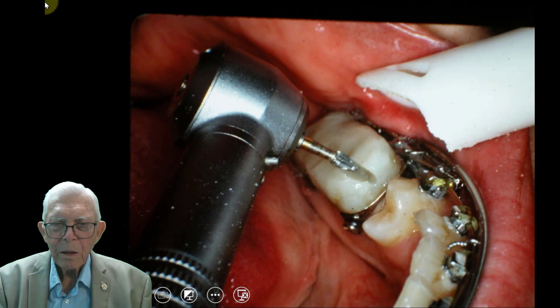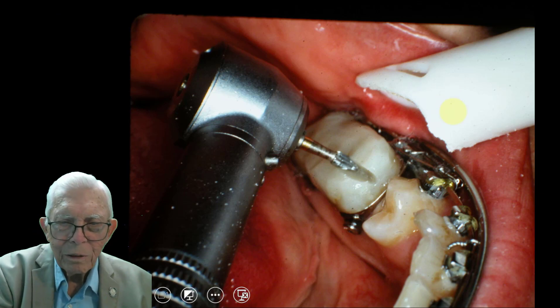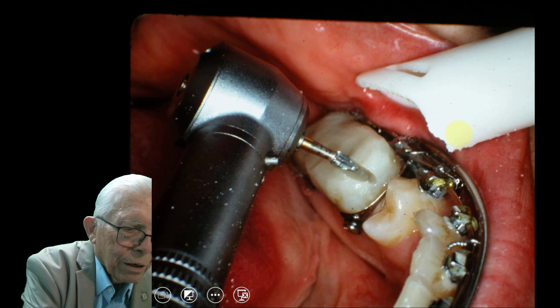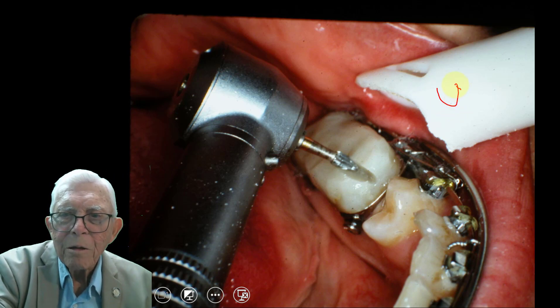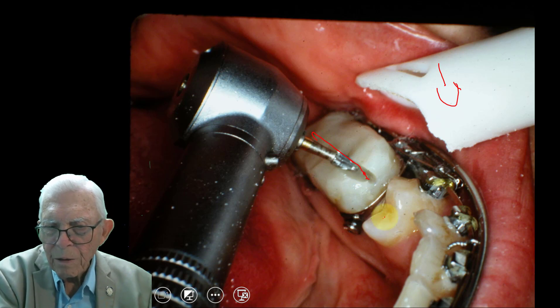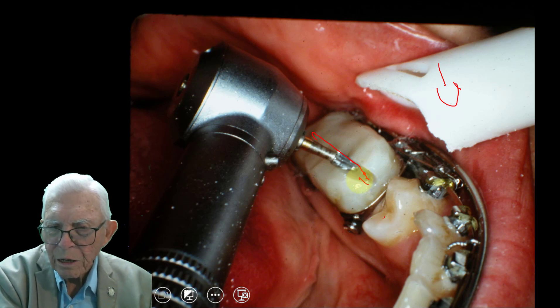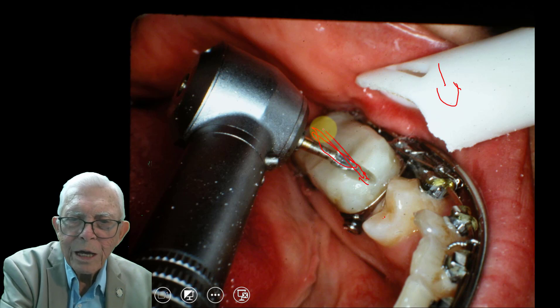This is the only video in this whole stack where we take these blocks off the teeth. You take a barrel burr — that's a burr that's kind of shaped like a barrel, with the shaft coming out. You take it and go right down the middle of the block. This material is a different color from the teeth, so if you get close to the tooth you can see it. We get as close as we can without touching the tooth, and we just grind this out like that.